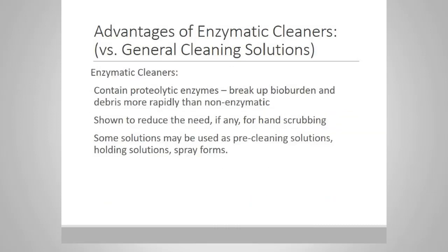Now there are different types of cleaning solutions, general cleaning solutions and enzymatic cleaners. And there are advantages to the enzymatic cleaners. These contain enzymes that will break up the bioburden and debris more rapidly than the non-enzymatic, and they're shown to reduce the need, if any, for hand scrubbing. Some solutions such as these can be used for pre-cleaning solutions, holding solutions, and of course there are spray forms as well.